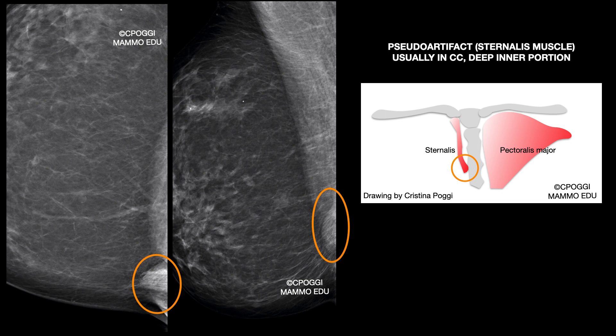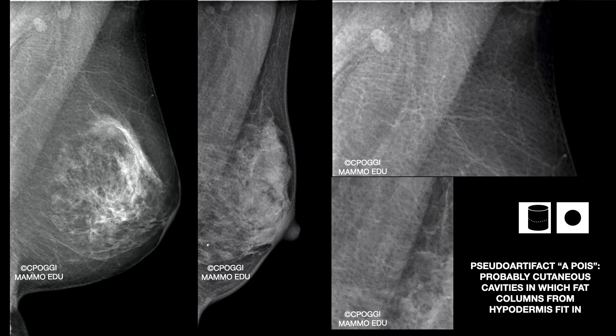It is an accessory muscle called the sternalis, in addition to pectoralis major. A very interesting pseudo-artifact, better seen on magnified images: these parts are probably cutaneous cavities in which fat columns from the hypodermis fit in. They appear rounded because they are actual sections of a cylinder, and radiolucent because they are made of fat.